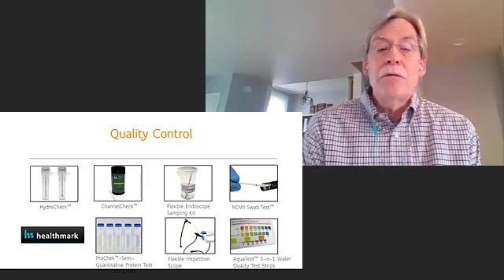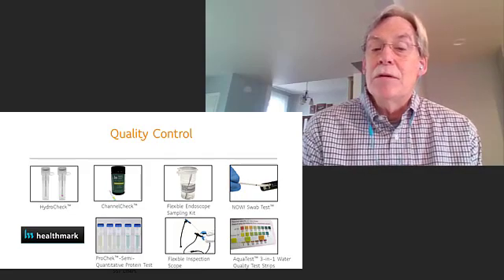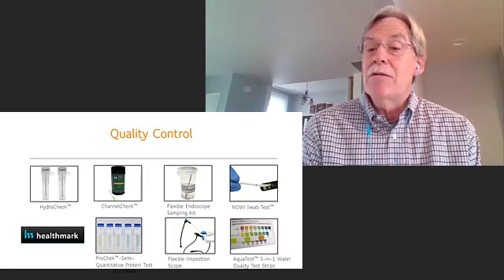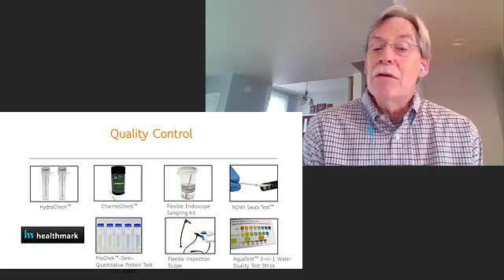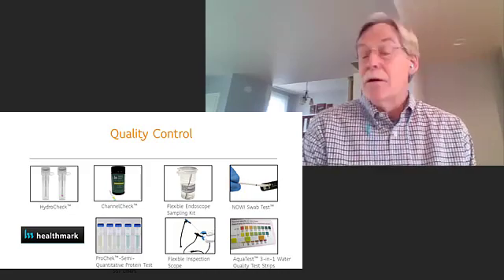On the top right of the screen, you see the Now test. It's another post-processing surveillance option. It's a simple 12-hour test for gram-negative bacteria. Why this is important: it can be very helpful in limiting the downtime a scope is out of service awaiting surveillance test results. Lower left, back to cleaning verification.